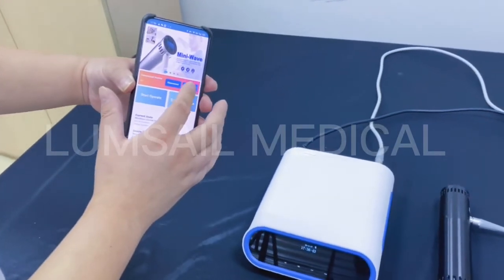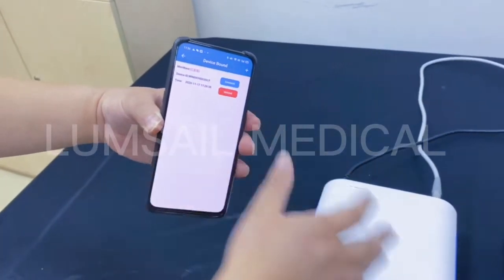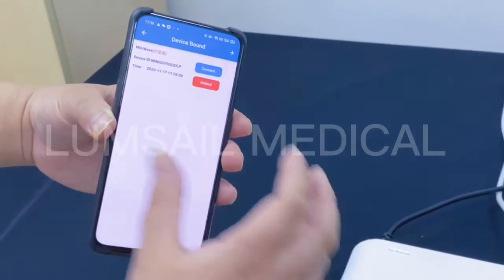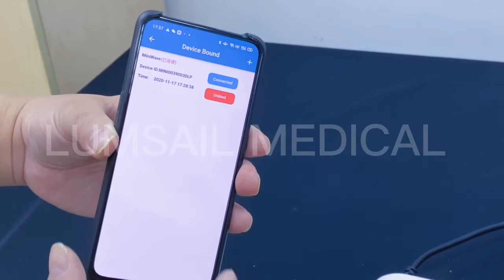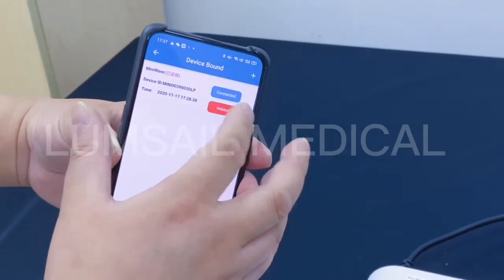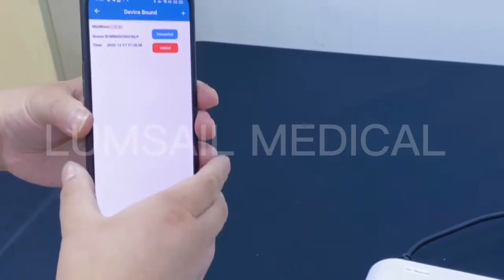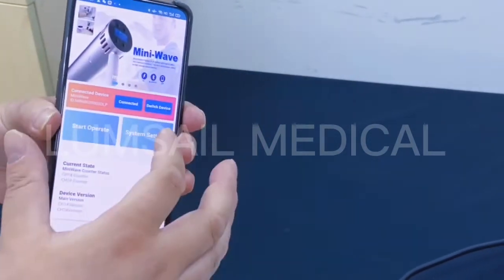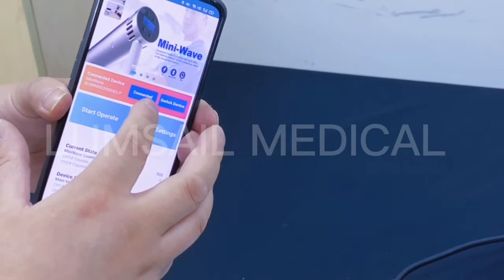We need to check the connected device. You can see here that one device has already been discovered. We click the connect button and it shows 'connected' — the cell phone now has a connection with the device. We can go to the main menu and here you can see it is attached and connected.